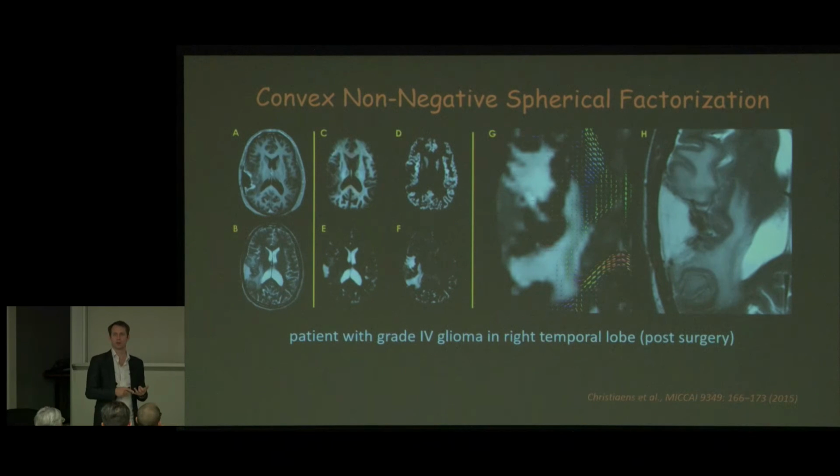So far we've just looked at grey matter, white matter, CSF. Here's a tumor patient who had a resection here, and there's edema. And if you do this unsupervised response function estimation and you tell it I want 4 responses, you get a 4th component, which is the edema component, coming out very cleanly. And that overlaps with the white matter part. So you can see this is the white matter ODFs superimposed on the edema density. And it corresponds quite well with the T2 image as well.